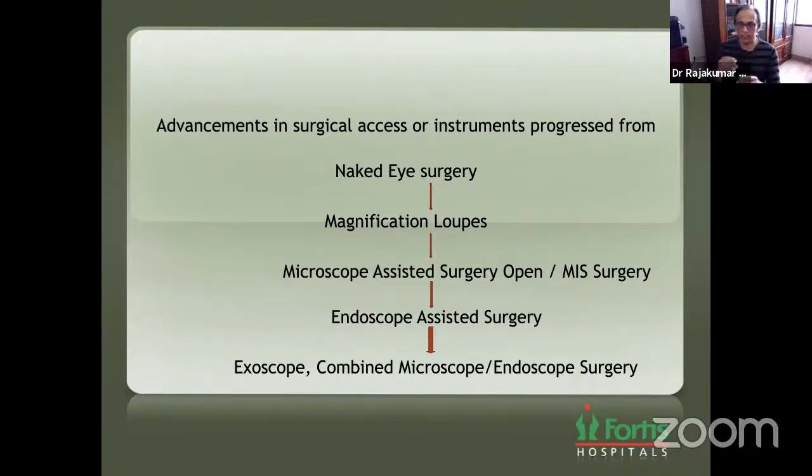All of us learned surgery using our eyes. And then we started using the loupes, getting some fixed magnification. Then we started doing microscope assisted surgery, either open or MIS. Then we added endoscope assisted surgery. And now we have a combination of exoscope, microscope, endoscope, all coming in together to give us improved visualization.